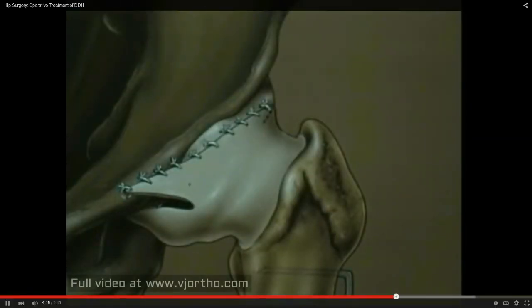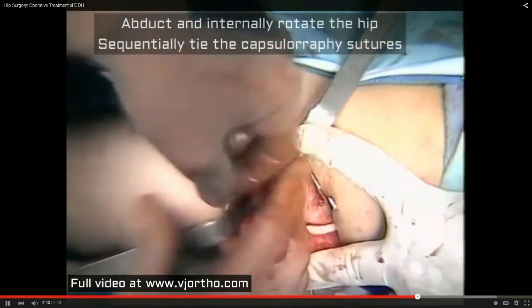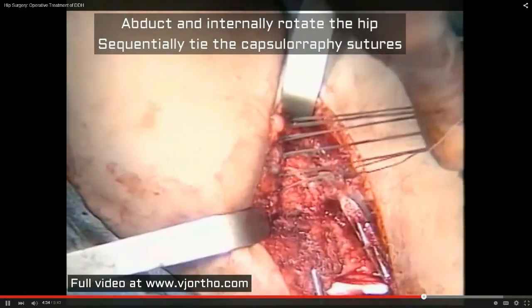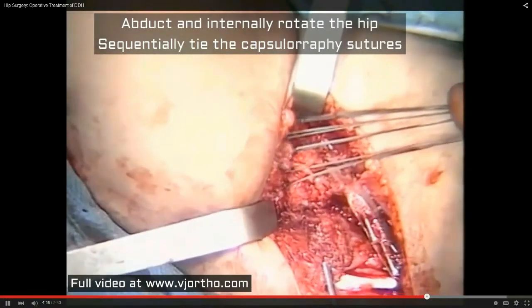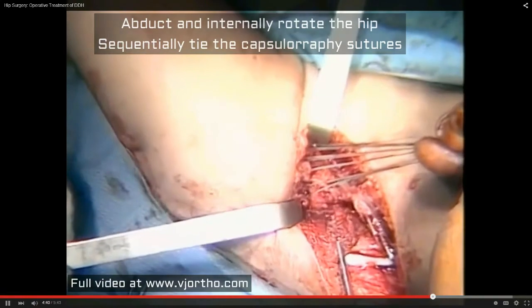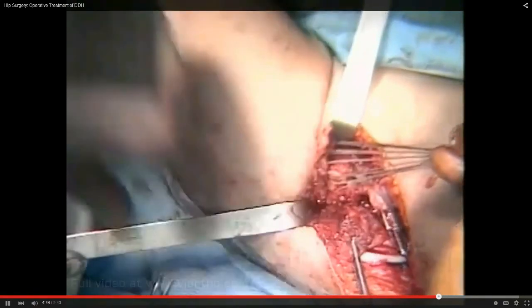We state that it should be similar to a hernia repair — a large segment of capsule is actually taken out and discarded. There are many ways to do it, but the method we use is that of Salter. With the hip held in abduction and internal rotation, the capsulorrhaphy sutures are sequentially tied. I can now take this hip, adduct it, and try to push it out, but there is no place for it to go, because I extinguished the sac in the back.